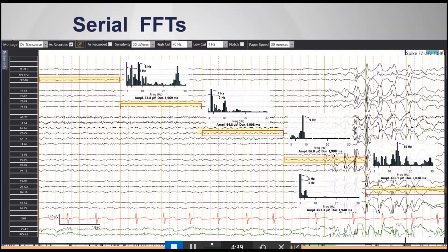When we do a frequency analysis for trending, we're simply doing serial FFTs and putting that data on a graph. Each epoch can be two seconds or longer — two minutes or any amount of time. We're simply converting information from the time domain into the frequency domain. All of the trends mentioned use the Fourier transform as the basis for their analysis, and each one has a unique method of displaying the results.